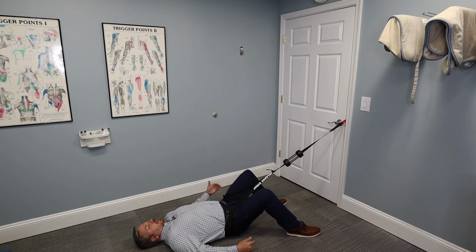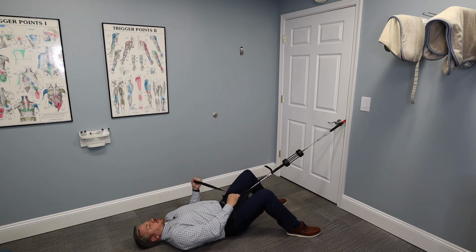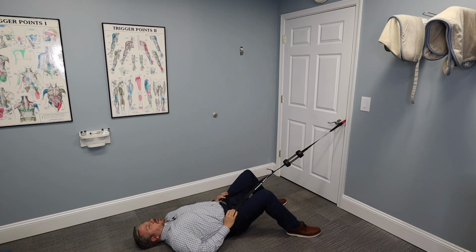You could also put a pillow underneath your legs to give you even more relaxation, but this works pretty well. And depending on how big you are and how much of a stretch you need, you either may need to move further or closer to the door, just depending on the stretch. But again, to relax it, you just pull towards you like that, and that gives it some release right there and takes the pressure off. And then if I wanted to stretch it again, just relax.